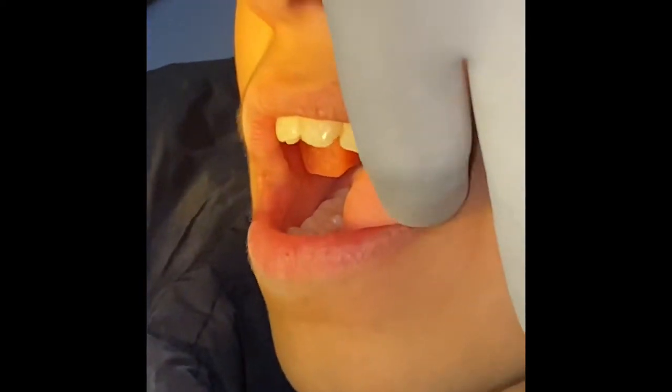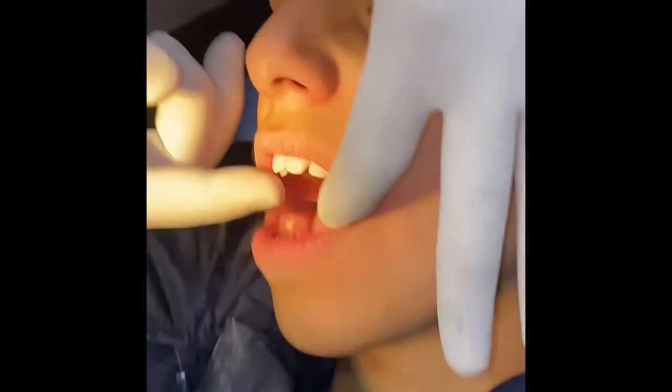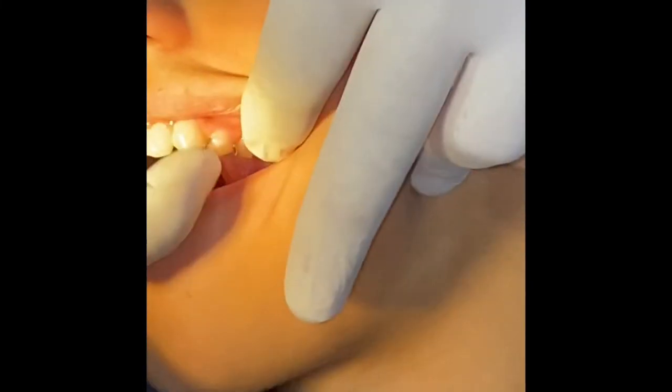Here you go. Do you feel the difference between the left and the right side? Big open? In terms of retention, this is fine.